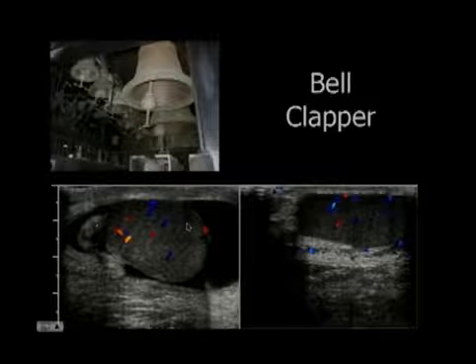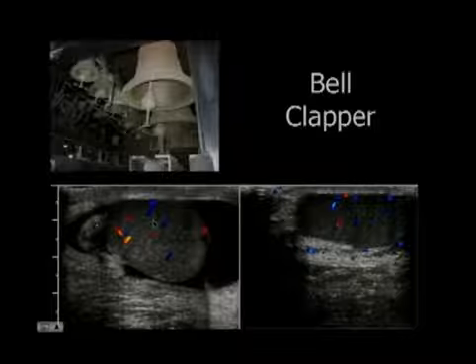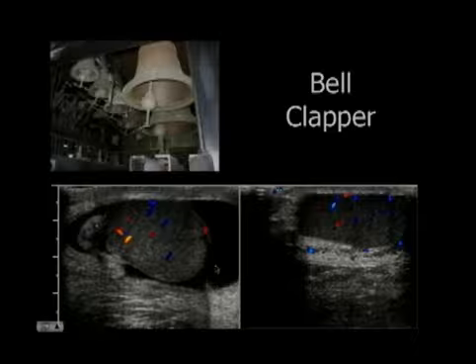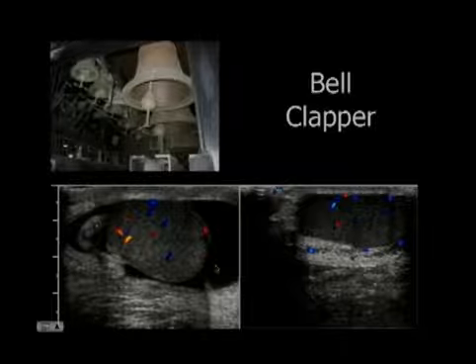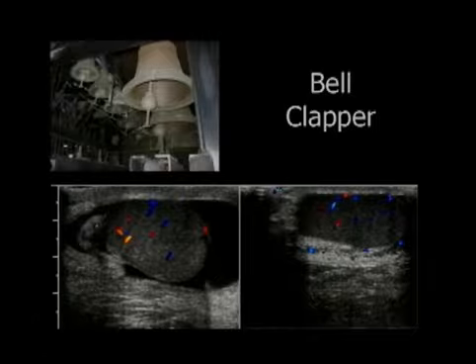Now, this child had acute scrotal pain. He's got an enlarged testis compared to the other side, but right now he doesn't hurt, and that's a key thing that we'll get into. His pain is better. He does have flow. He doesn't have a problem right now, but this is abnormal. This child has abnormal fixation, and while he may not need an operation now, he certainly needs to go see the urologist to get PEXed, and he also needs to be aware, as does the family, that if he has recurrent pain, he has to come right back, because he is a setup for recurrent torsion.